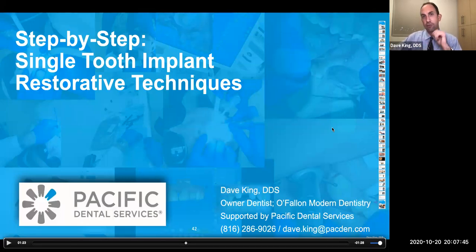Even though we have some super translucent multi-layer zirconias like the Katana blocks, which we have some of, bondability-wise and control and aesthetics, being that I don't do a whole lot of infiltration zirconia staining techniques, I feel much better off using Emax because it's tried and true. It's been out there. There are more materials coming out, but generally I'm comfortable with Emax. I have Emax in my mouth. I trust the material itself, and it's a good material.